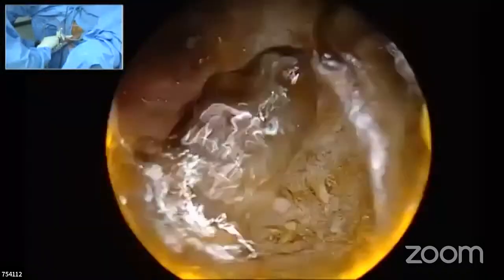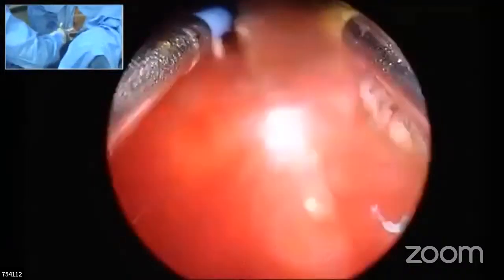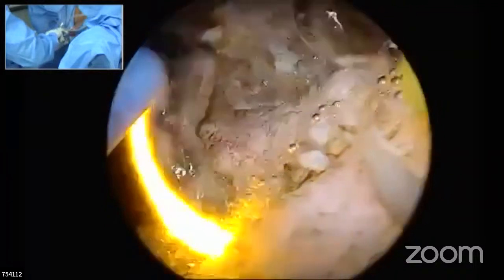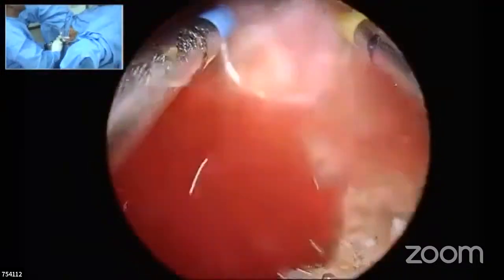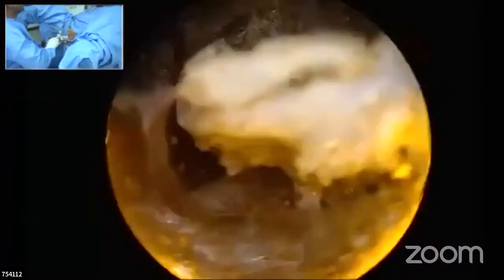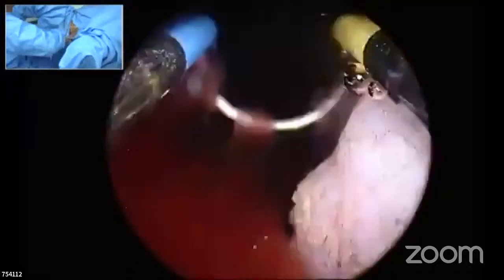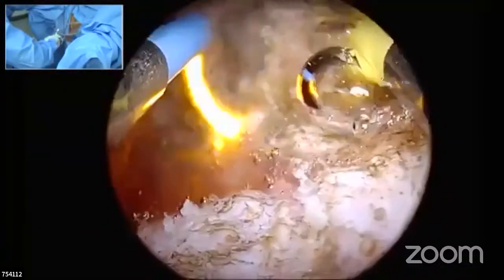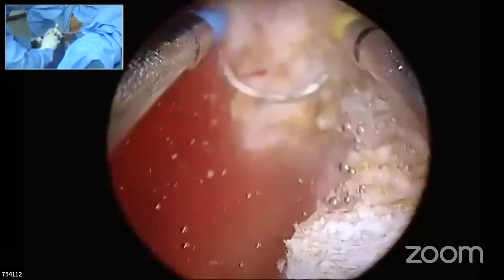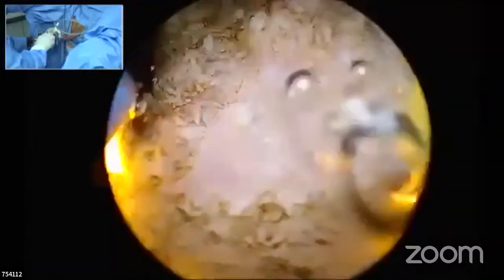Yes. You would still not want to put on a 26 sheath on it and make it into a continuous irrigation? No, sir. I always resist using a bigger size sheath unless warranted. Like the next case, possibly it's a huge gland, so we think about putting a bigger sheath and Iglesias. But practically speaking, this resection will not take much time. So I may empty it 3-4 times, because for demonstration's sake I'm taking a little more time. But otherwise, with any of these size glands, we don't really put a continuous sheath at all, sir. Just for saving the urethra.